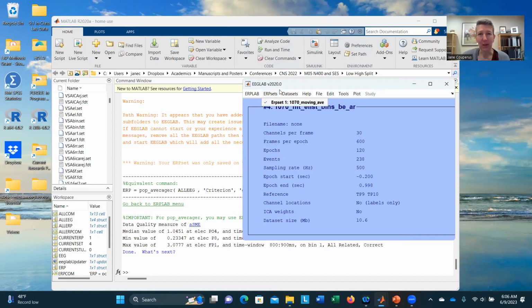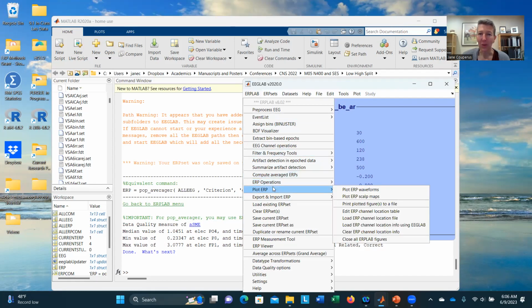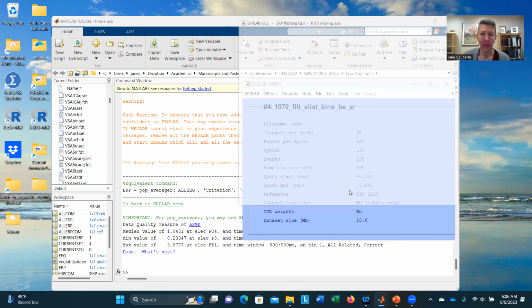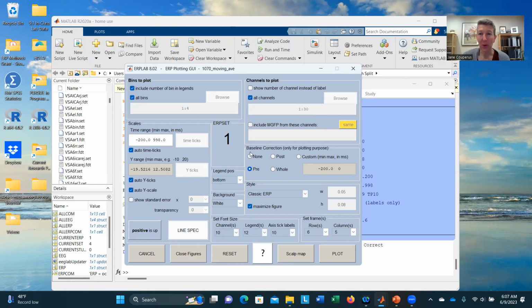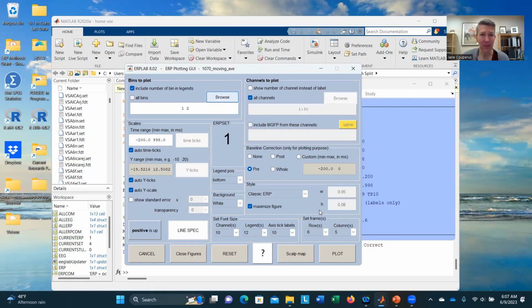And then the last thing I'm just going to briefly show you is how you would look at this, because this is now an ERP, not an EEG. We're going to look at that using our ERP lab plot tool. So here we're going to plot our ERP waveform. It's going to pull this up. And it's going to ask you a bunch of questions, the most important of which right now to know about are which of the bins are you looking at? You might not want to look at all 4 bins. You might decide I am only interested in, say, 2 in this case. And again, I use Control to select multiple things.